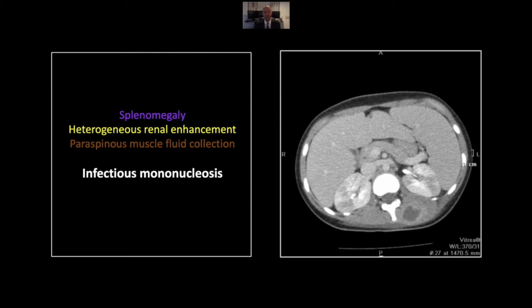Our next case is infectious mononucleosis. The most common finding is this splenic enlargement, pretty much the hallmark of the disease. Many people don't appreciate the extent to which infectious mononucleosis can cause nephritis and hepatitis. We have the nephritis here, a very nice demonstration of viral involvement of both kidneys, causing very much the same appearance as pyelonephritis might. In addition, an additional diagnostic clue here is this paravertebral abscess in the soft tissues. Remember that there is reduced immune surveillance and function in these patients — it is a white cell infection that does put them at risk for secondary infections, as in this case.